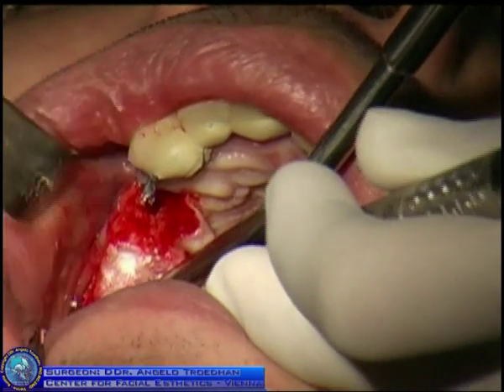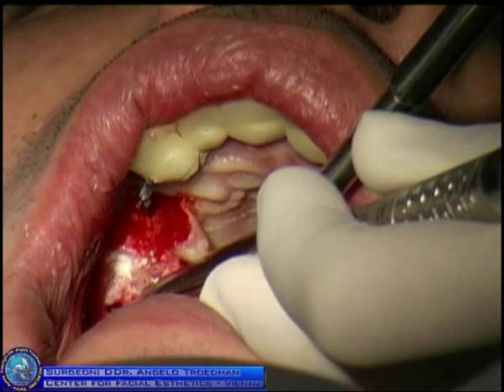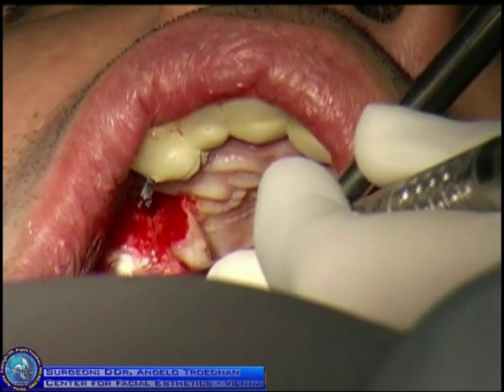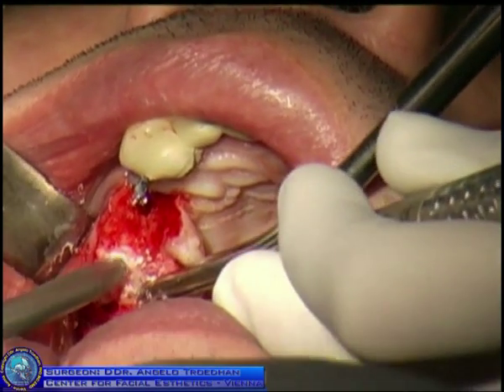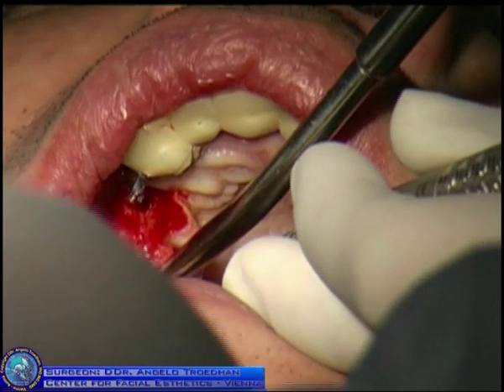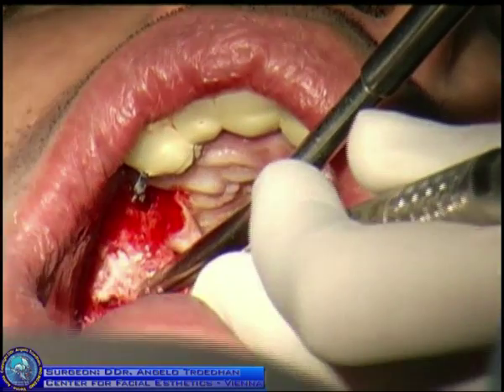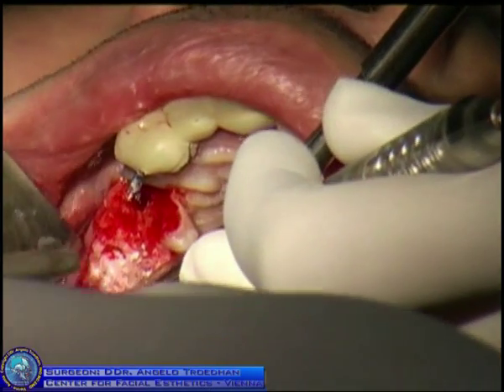And since we know that our patient is very sensible with his vagal nerve, if the sinus would not be proof, in this position the water would run down the throat. The water would actually pass from the sinus directly to the throat. And our patient would immediately start choking.